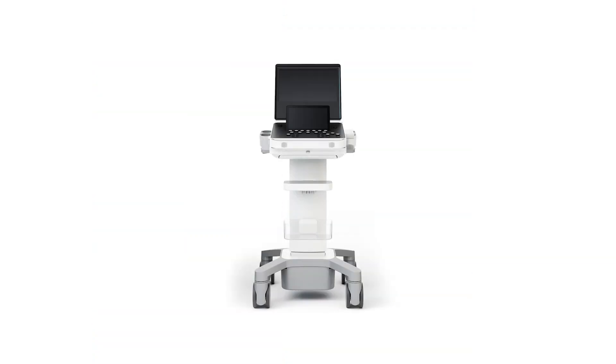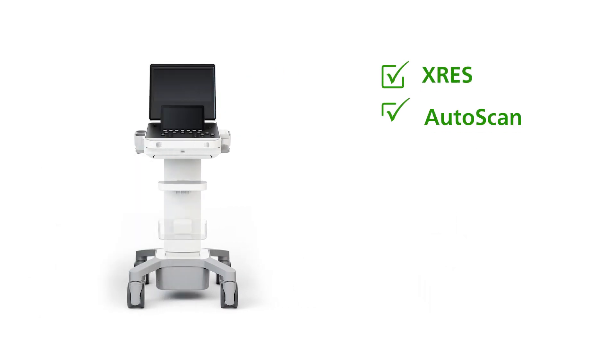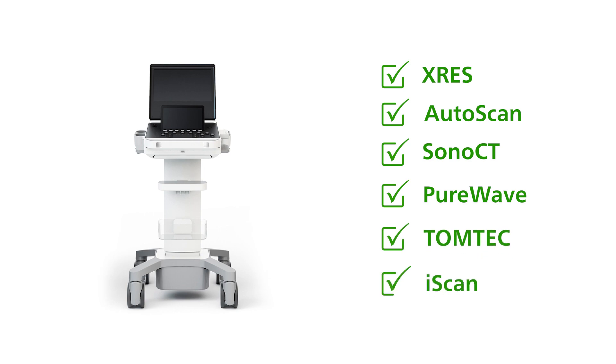The Compact 5000 Series inherits our Philips DNA to include X-Res, AutoScan, SonoCT, PureWave, TomTech, iScan, and more.